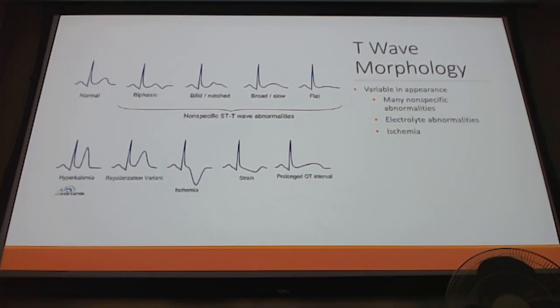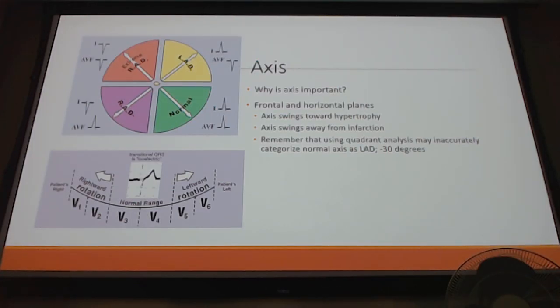What's important is just looking at the morphology of the T wave. So when you start to get an increased size in those T waves, we call them hyperacute T waves, and that could be a sign of ischemia or pending infarction. And it may not have manifested yet. We have those peaked T waves that we see with hyperkalemia. So all of this can help guide us on the EKG, what we think it is, depending on which leads, which we'll cover next.